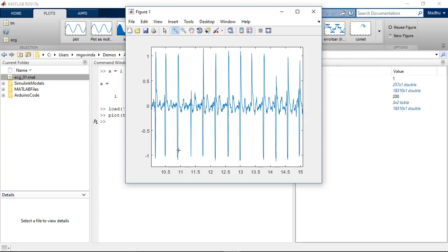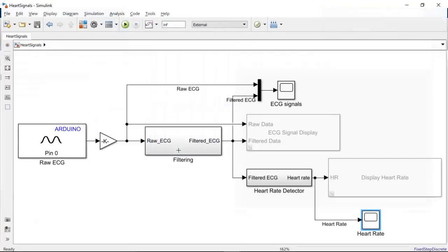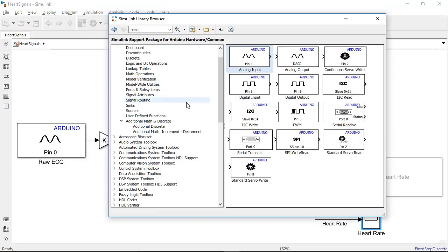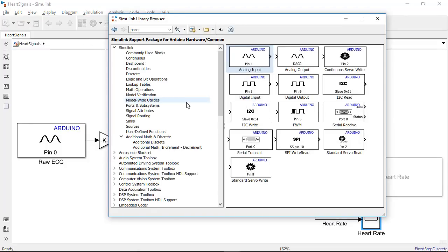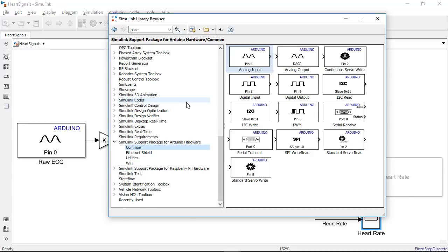Now let me introduce Simulink and show how I was able to test the algorithms on the Arduino. Simulink is a graphical programming environment which has libraries. These libraries have blocks that can be used to model and simulate dynamic systems, and you can also use them to develop embedded algorithms.